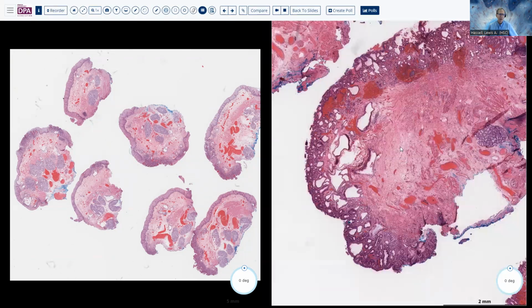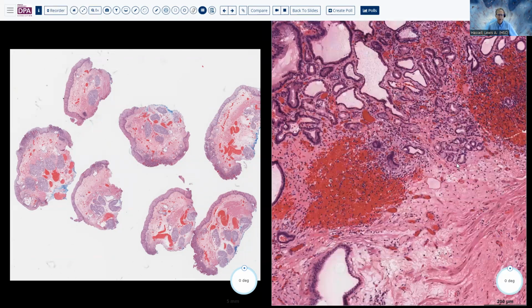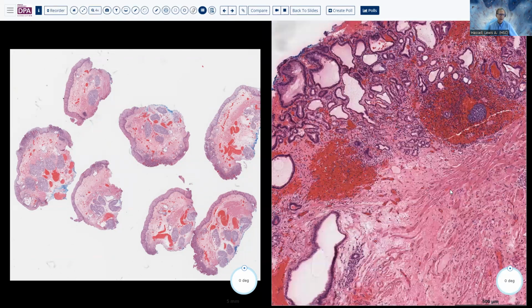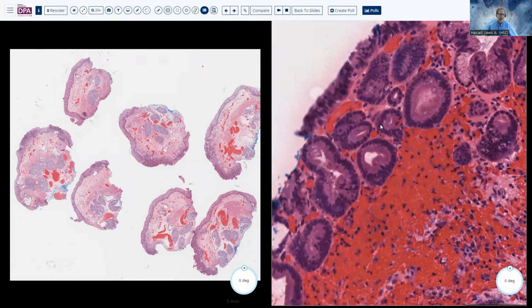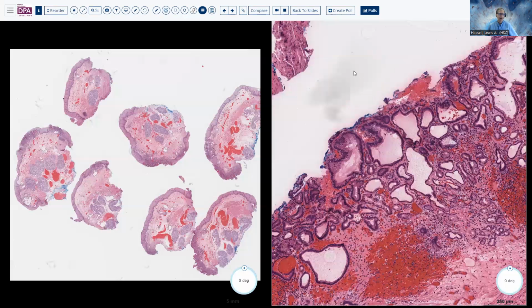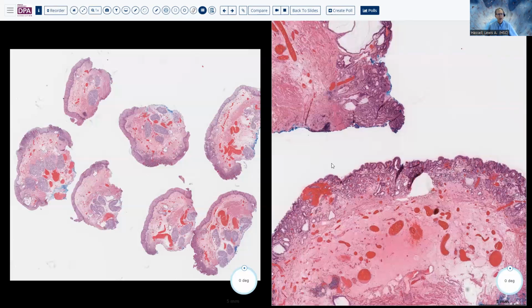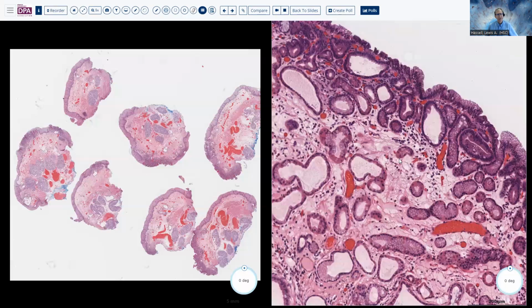And then we come over to this one, which looks a little bit busier. But again, we see here are these deep glands. And notice here we don't have that kind of high-grade atypia that we saw in the other sample. But we do see, again, some stratification, some hyperchromasia. Now, we don't grade the dysplasia based on these subsurface glands, although they can certainly harbor dysplasia, but it's the presence of dysplasia on the surface epithelium that is what we really like to see to be confident in our diagnosis. And then I think there's a nice area up here, which shows this again quite nicely.